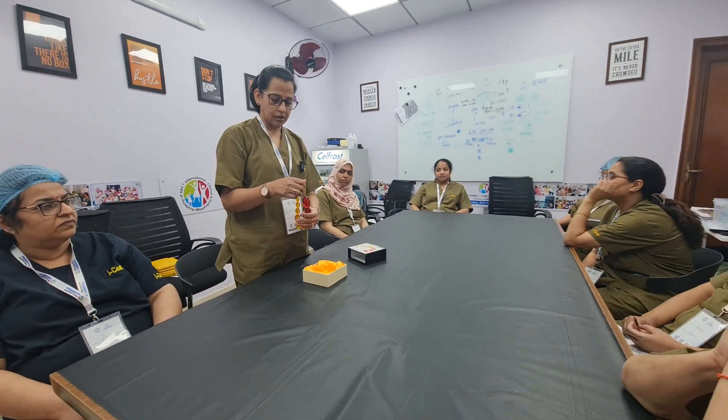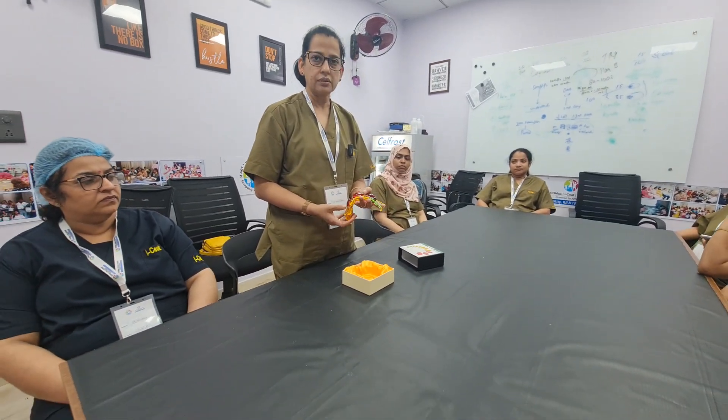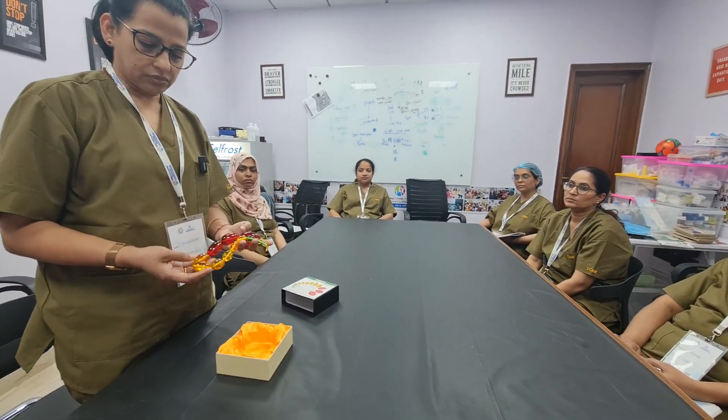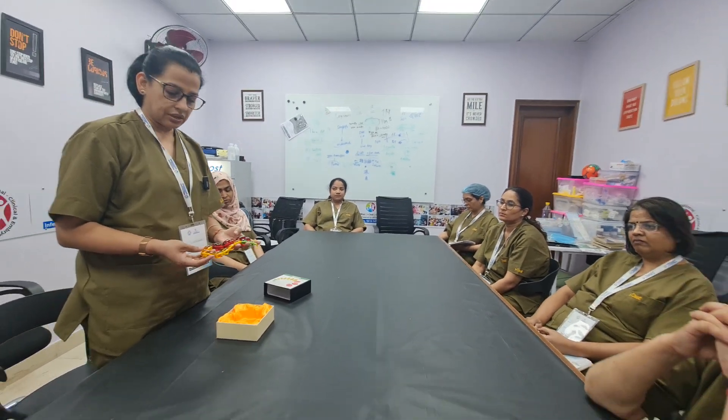During the male examination, estimation of testicular volume is very important, especially in the pubertal age group, which can give us an idea about the adequacy of the testosterone level and the testicular volume using these rosary beads. In the pubertal age group, smaller than expected volume can give us an idea about primary or secondary hypogonadism. And larger volume might indicate towards some abnormalities like fragile X syndrome, etc.